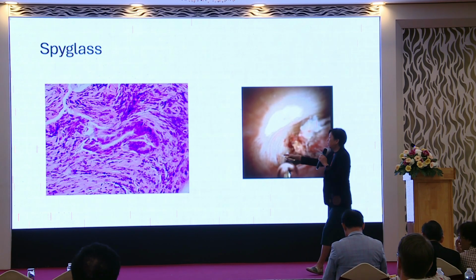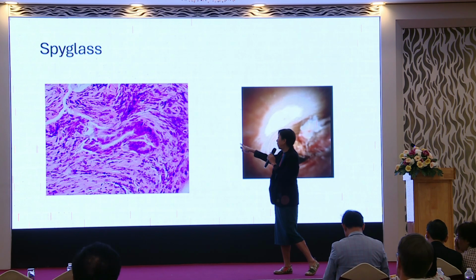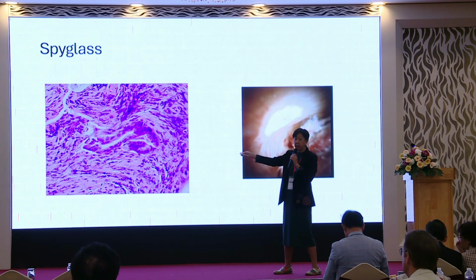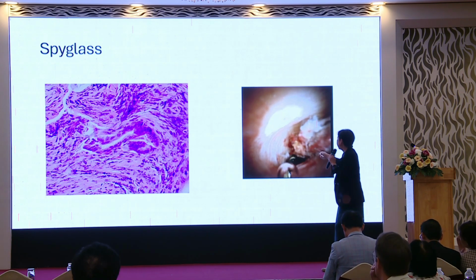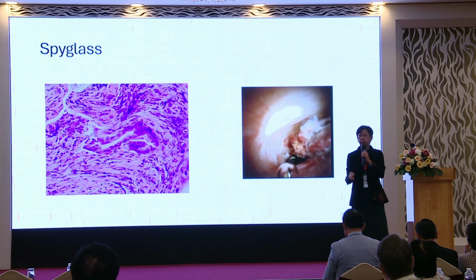So this is one of the specimens we got from the spyglass. You can see there's a lot of crushed artifact, but we could call it carcinoma in this because it's invading. And this is what the clinician will see through his spyglass. So he's trying to fight that small thing.